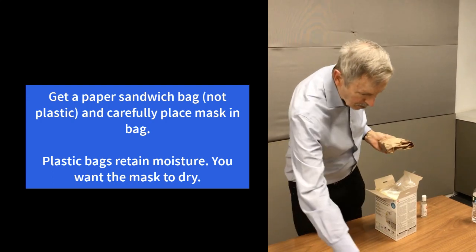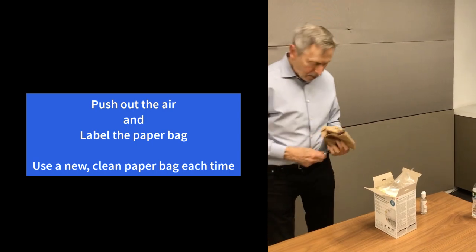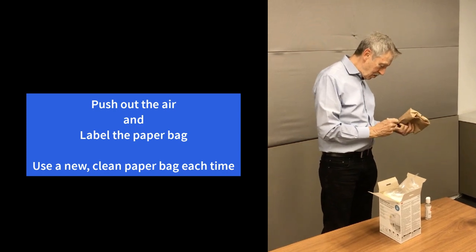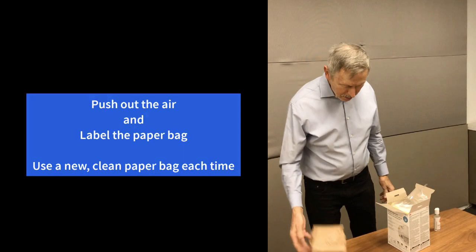Of course, you need to write down who you are. You don't really have to mark the front or the back of the respirator because it'll be a concave disc-shaped sandwich bag, and it'll be pretty obvious which side is the front and which is the back.